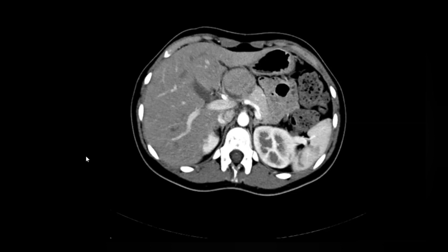Okay. So in summary? Sir, I would like to take the history of some pancreatitis. Don't ask for the history unless you want to confirm one diagnosis. Don't jump to the history.